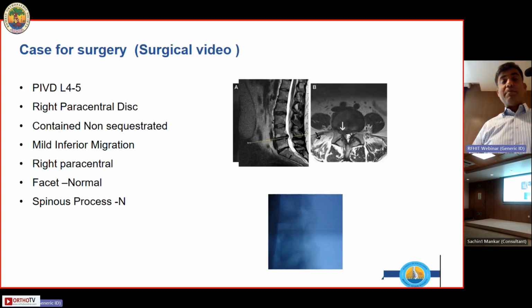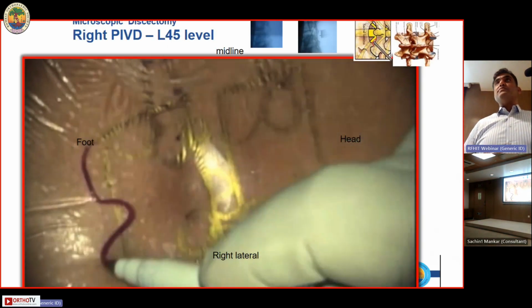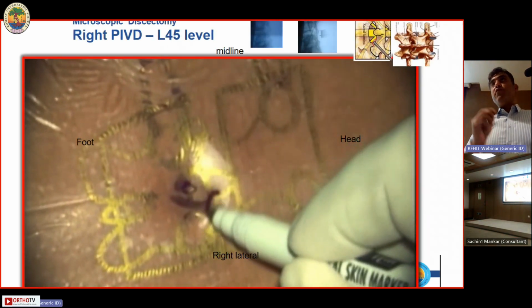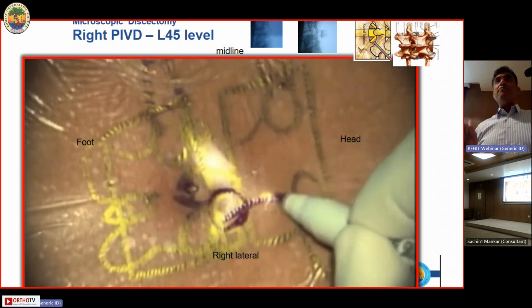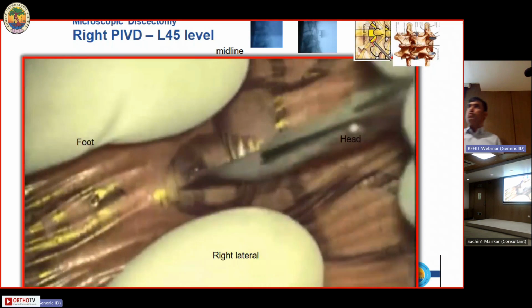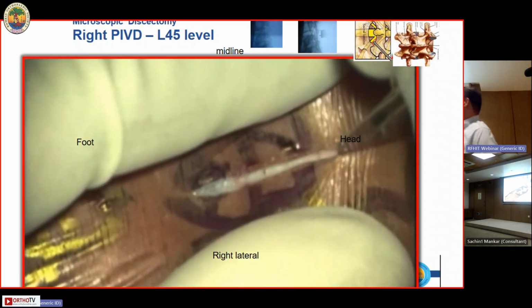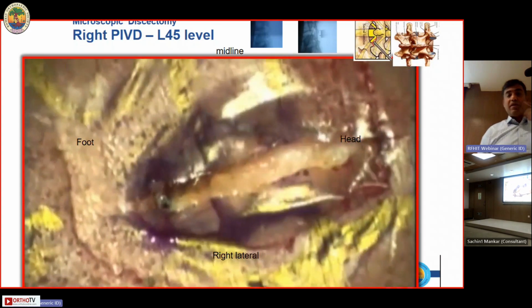So the video that is coming up is all about doing the surgery from the right side of the patient, where there is a right-sided symptom, right-sided disc herniation in this patient. Surface marking is imperative, before your incision comes, to keep your incision bare minimum, and your level marking. So what I do is I generally put in a needle there and do a check on the C-arm, as you see the needle out there, and then your retractor gets placed, which is again confirmed intraoperatively.